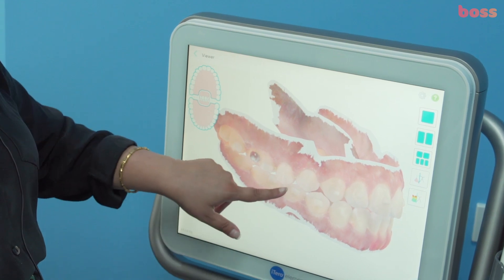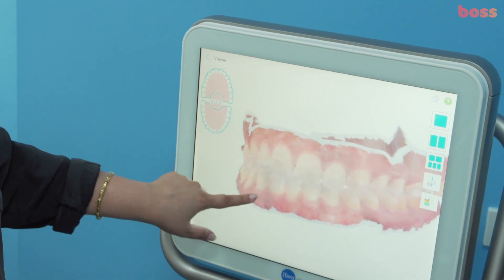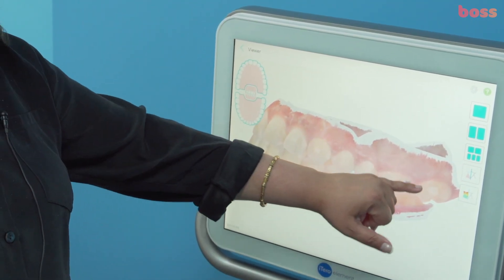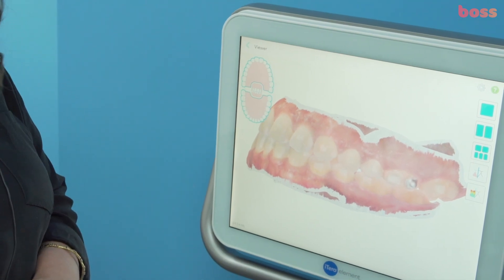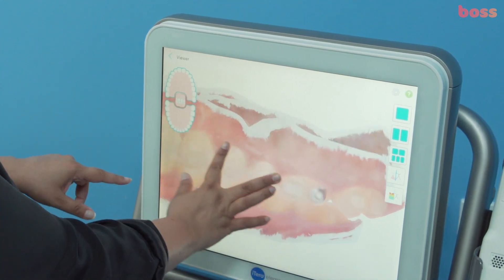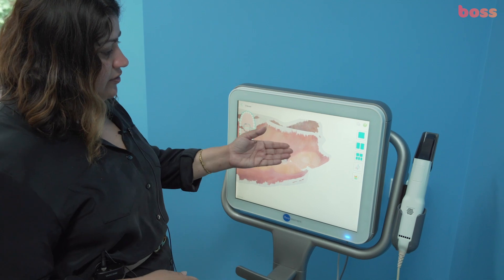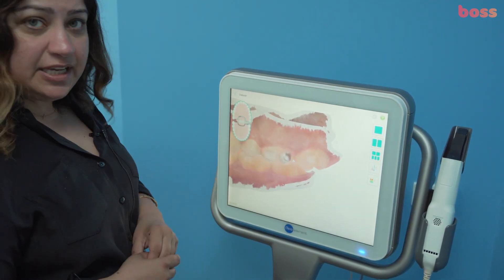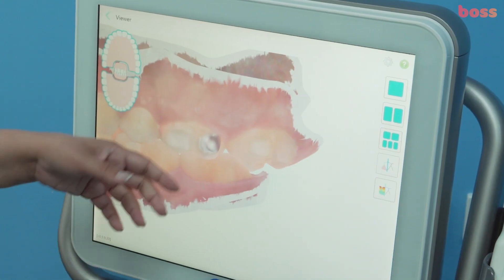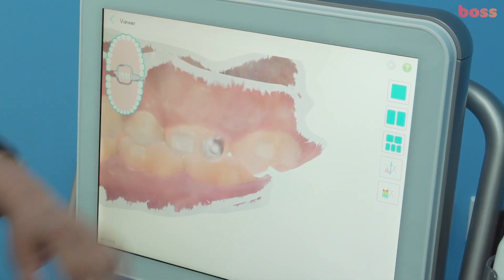We'll tell our technician to intrude tooth 15 by about a millimeter, and 17 and 16 by about half a millimeter. Keep 14 as is. We're going to extrude 13 to 23 by a millimeter, and intrude 26 and 27 by about half a millimeter. Tooth 27 needs a bit of buccal root torque — the root should move buccally and the crown a bit lingually. You should never see the palatal cusp hanging down like that. We'll ask for about 5 degrees of buccal root torque on 27.